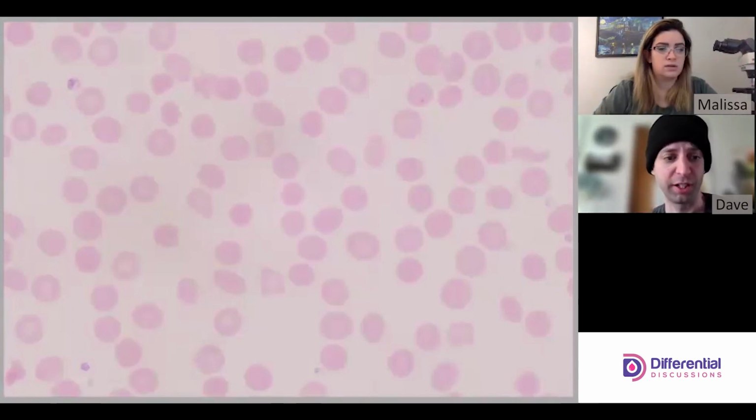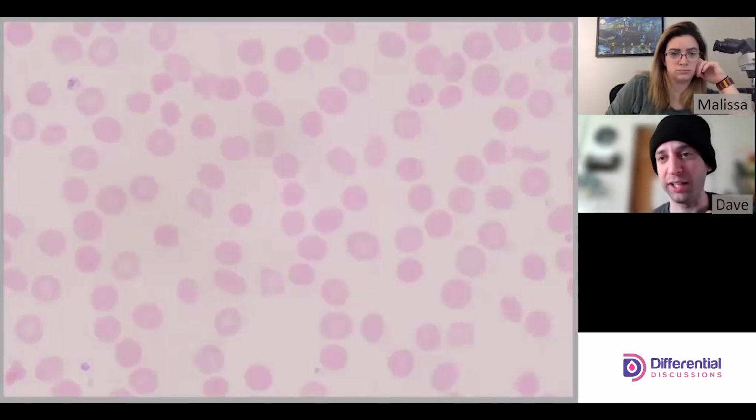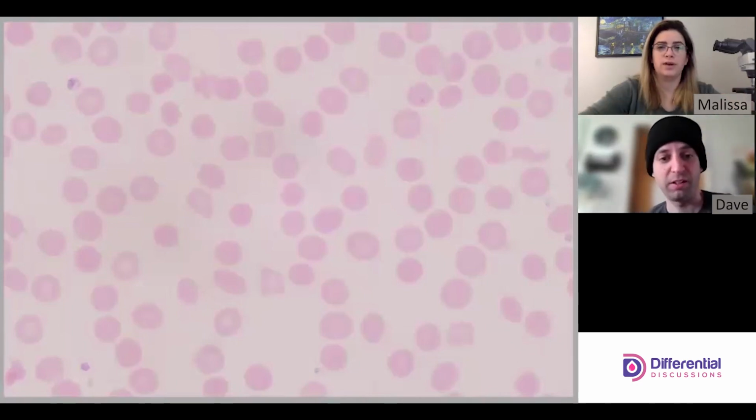Split the difference there. Yeah. And then we have spherocytes. It doesn't hit our threshold for calling. Ovalocytes noted, but we're not going to call, right? Occasional acanthocyte, maybe. Yeah. So more or less, the formal result would be 2+ echinocytes. Yep. Yeah. 2+ echinocytes. Yeah, I agree.